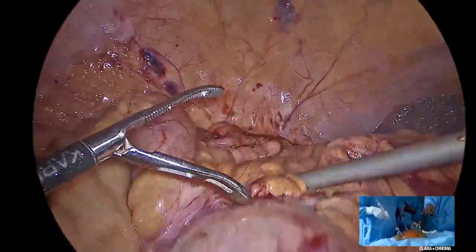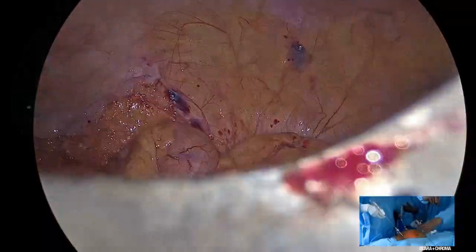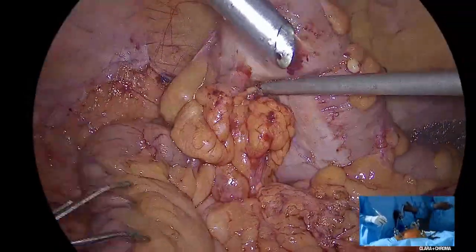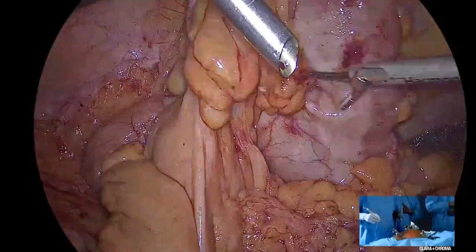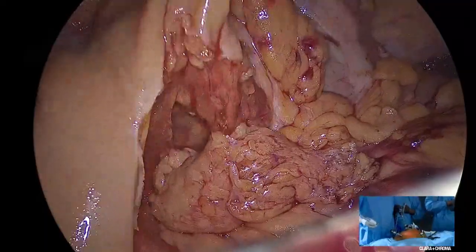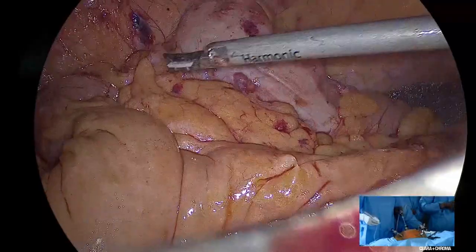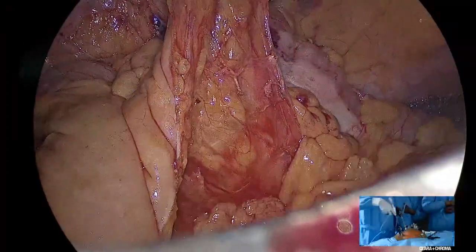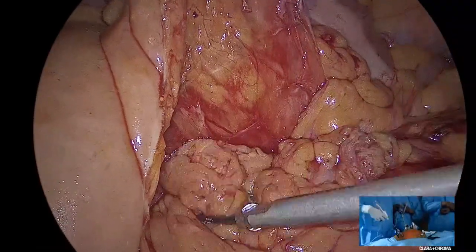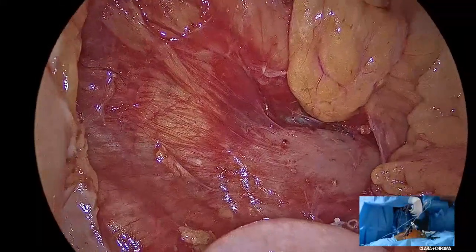Right, so I think that's enough for now. Let go, Gaurav. Just to recap, that's the cecum and terminal ileum. And the ileocolic pedicle is happy with that, Anil? This ileocolic pedicle? Beautiful, beautiful. We've got a good 6 centimeters. And I see that the mesocolon is also beautifully shiny. That is what you would want in a CME? Absolutely. That's what you're doing.